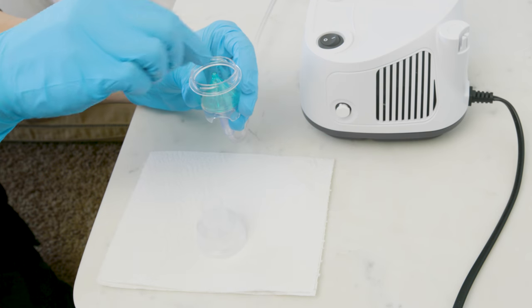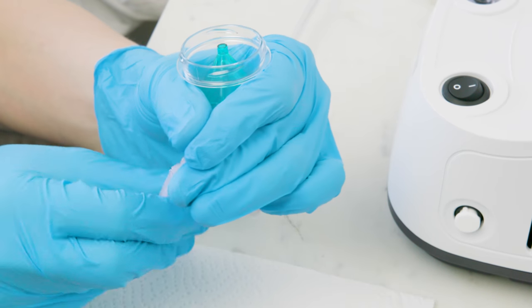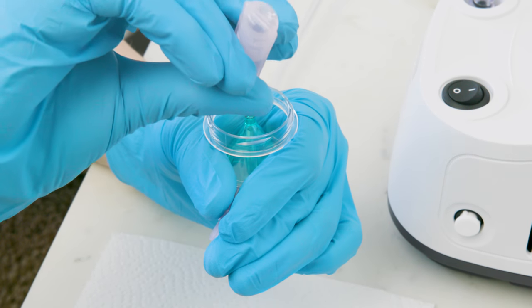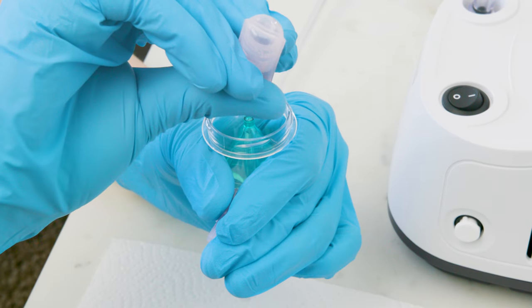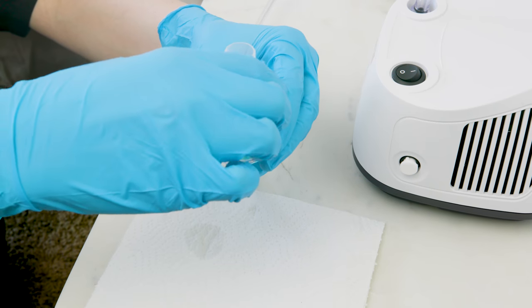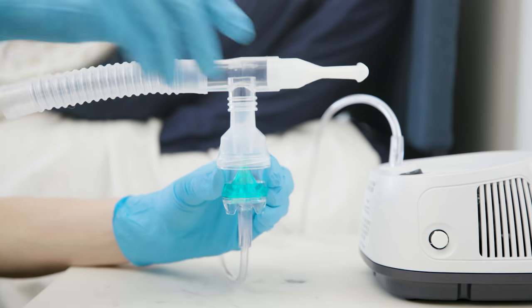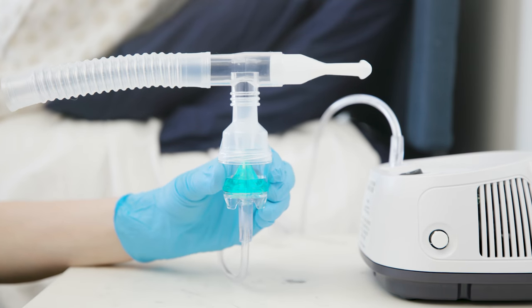If the cup has an insert, be sure it's in place. Pour the ordered amount of medicine into the cup. Then reattach the cover. Connect the delivery device to the neb outlet port on the neb cup.